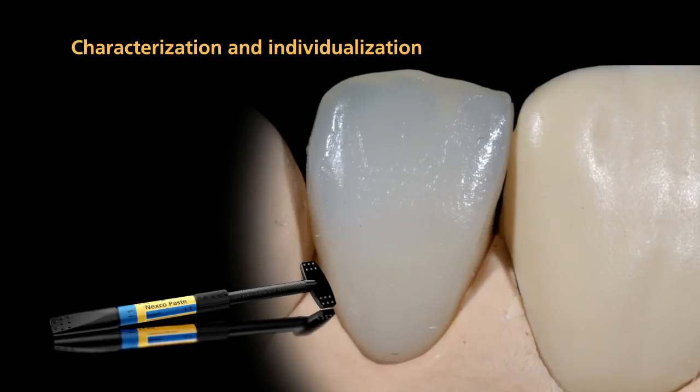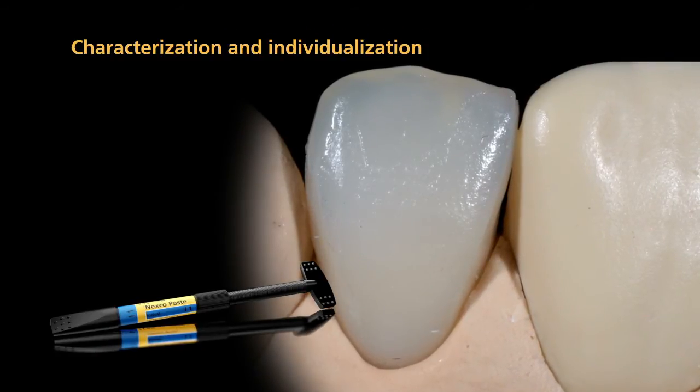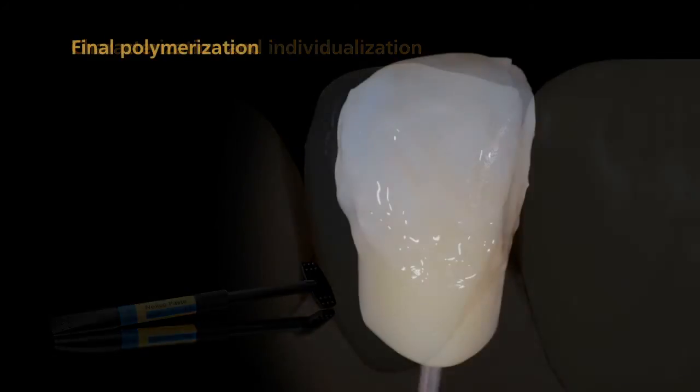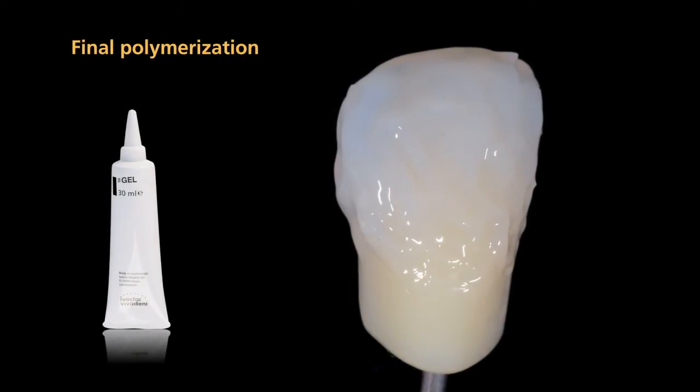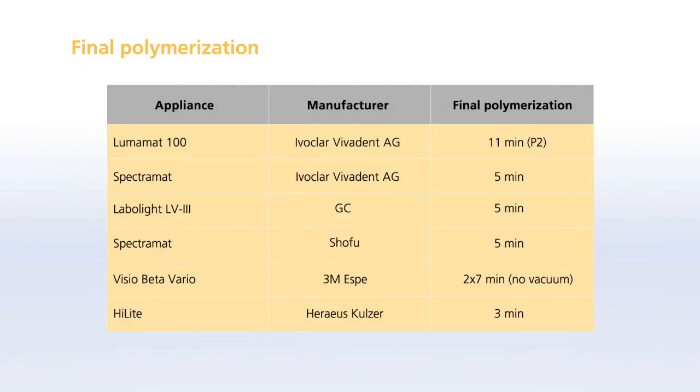After you have completed the characterization, cover it with a final layer of incisal material. Before the final polymerization, apply SR-Gel in a fully covering but not inappropriately thick coating.